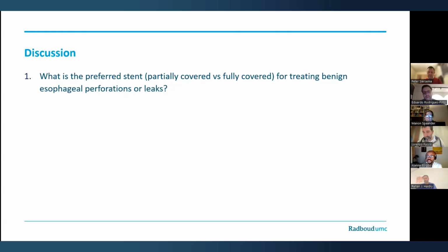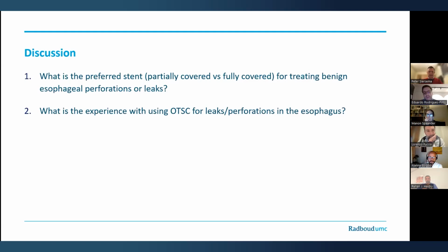Maybe we also need to mention at least the endoscopic vacuum stent in this situation. There is, I agree, limited data only on the endoscopic vacuum stents, but at least it may be an interesting option, work in progress also, but it may allow or enable the patient to at least take fluids and at the same time combine the advantages and the effects of endoscopic vacuum treatment. It would have been one of the questions I would have for you, this endoscopic vacuum stent. But again, I mean, we need more results there, but it's an interesting device to use in these patients as well.